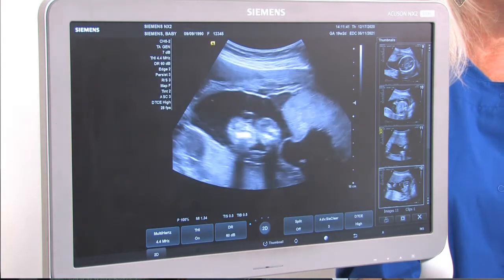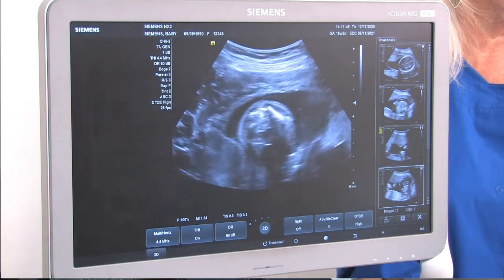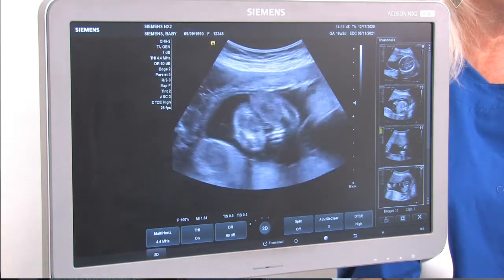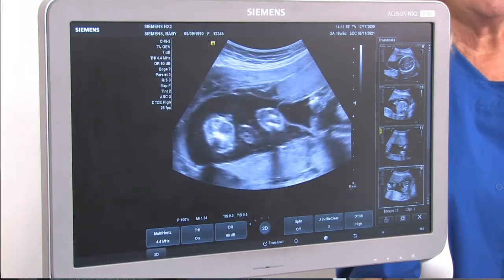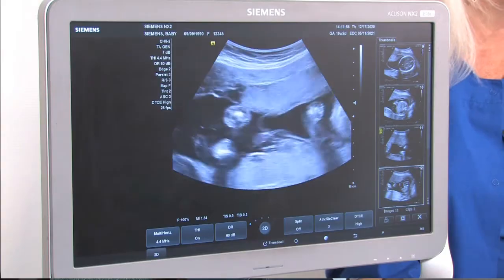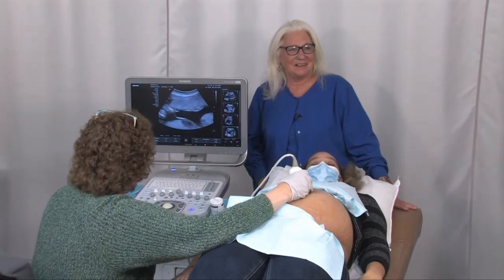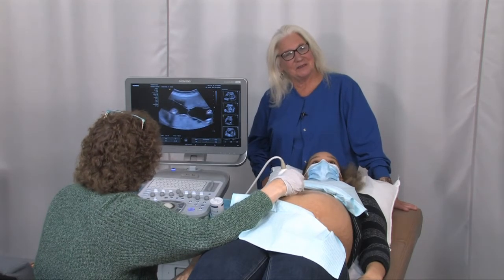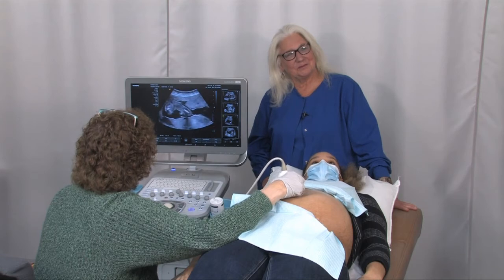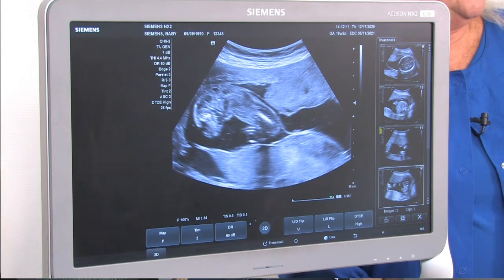This baby is not in a good position. It's going to have to move. We're going to see what this one is. Come on, flip around, baby. That'll be something. They said 2 girls, and then you find out one's a boy. Well, if they're identical, they can't be. They told you they're identical. Yes, they're identical. Then they both better be girls because it's hard to call them identical. Oh, there you go. We call them dichorionic, identical.